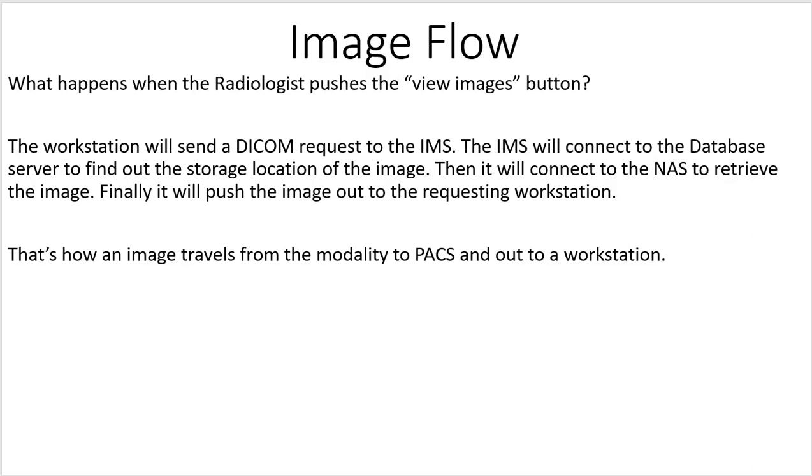What happens when the radiologist pushes the View Images button? The workstation will send a DICOM request to the IMS, the Image Management Server. The IMS will connect to the database server to find out the storage location of that image. Then it will connect to the NAS to retrieve the image. And finally, it will push the image out to the requesting workstation. And that's how an image travels from the modality into PACS and then out to the workstation.